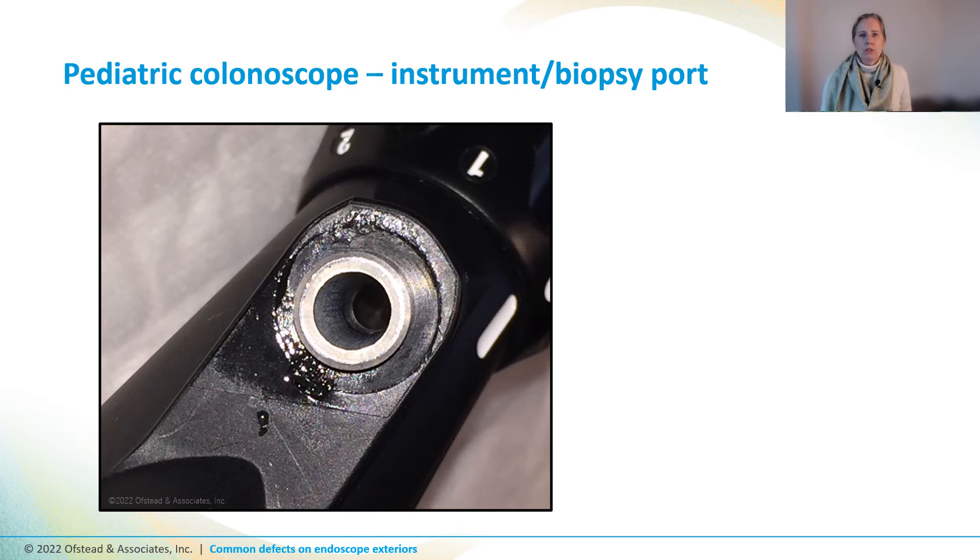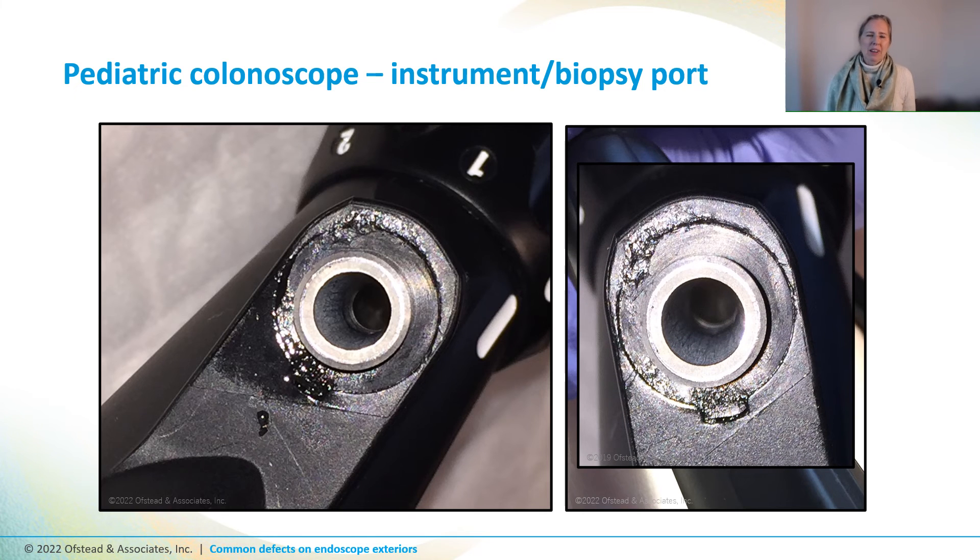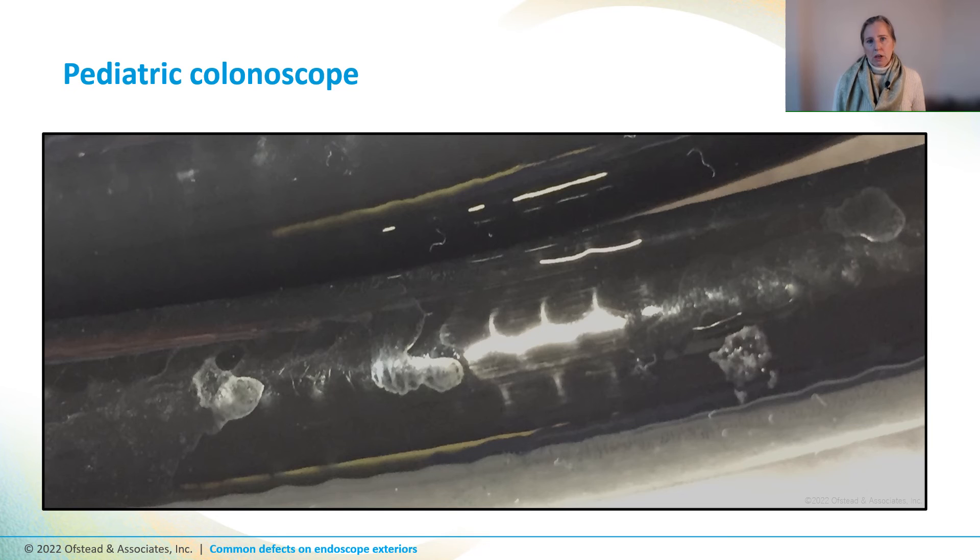Here's another colonoscope which had a puddle of oily, sticky stuff near the biopsy port. We took a swab to see if we could remove it, and it went away — that let us get a clearer look at the grommet, which looked really strange. Repair experts said there may be chemical damage to the grommet. When we looked at the insertion tube and universal cord of this scope, we could see thick white residue all along it, probably from insufficient rinsing or off-label use of insoluble materials.